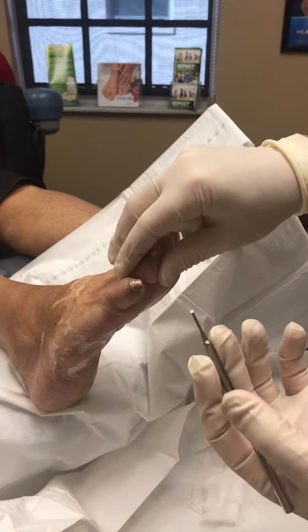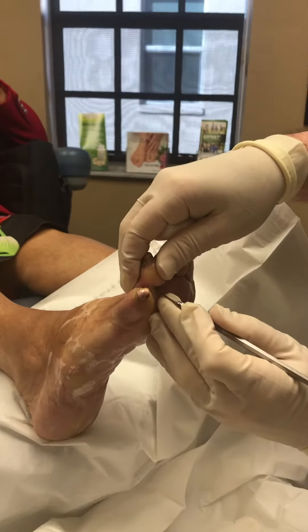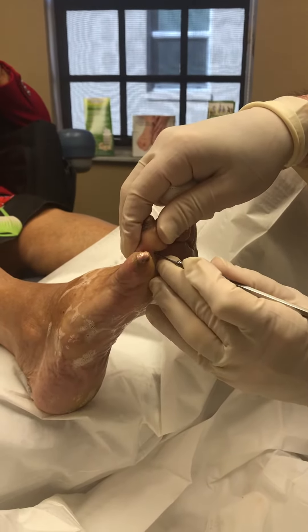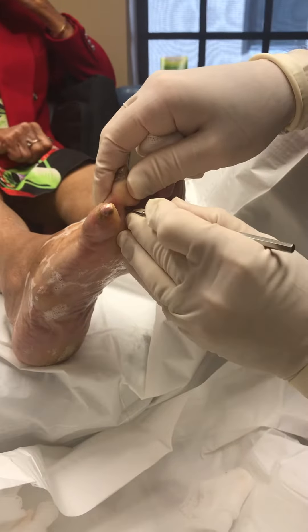We're going to attempt a flexor tenotomy to straighten the toe. We're going to go underneath where the contracture is and make a small incision with our blade, then palpate for the tendon.